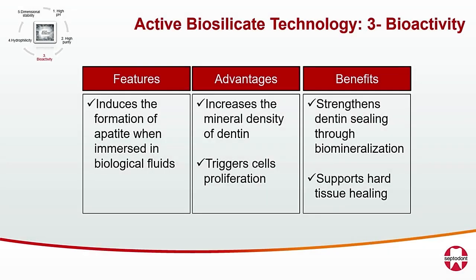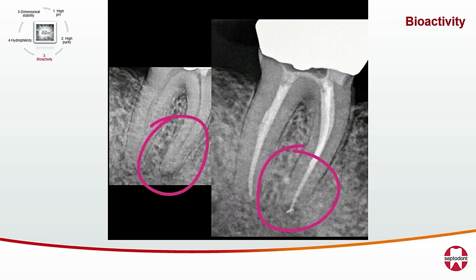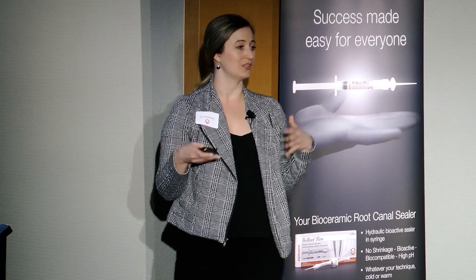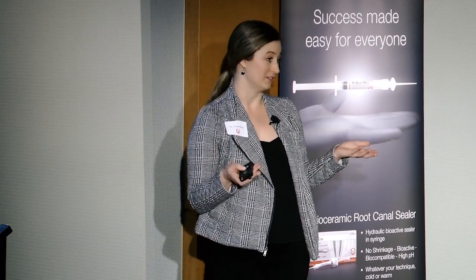In terms of bioactivity, it can strengthen dentin through biomineralization and support hard tissue healing, which is something we really want when we're eliminating apical periodontitis. So, here's kind of a cool case where there was a little bit of a lateral lesion associated with this necrotic tooth. And you can see I got a little puff out there as well. And I like to know that this is bioactive and it's going to help induce bone healing in that area.